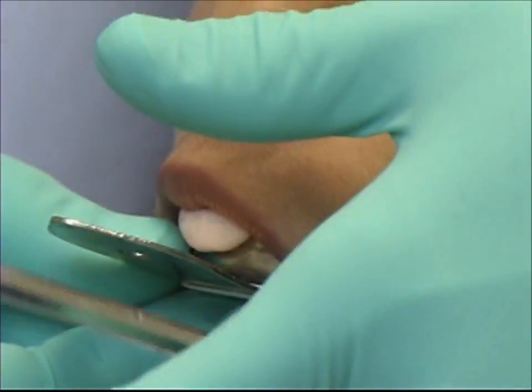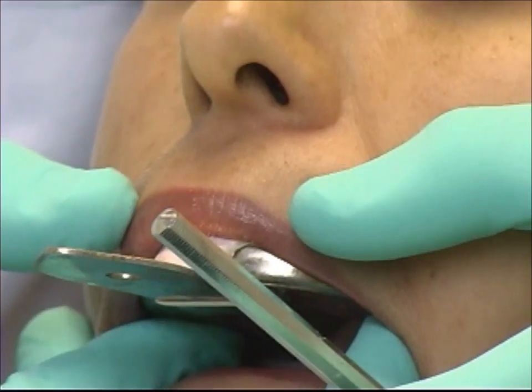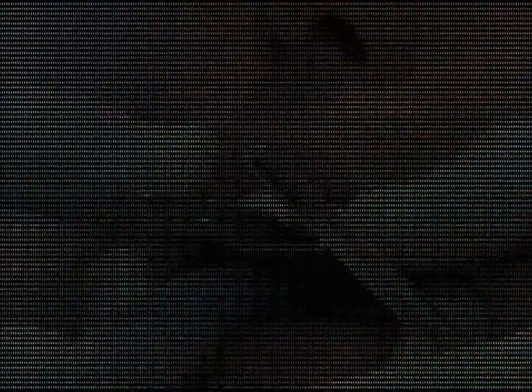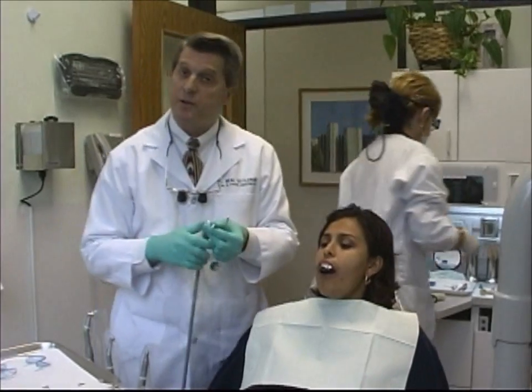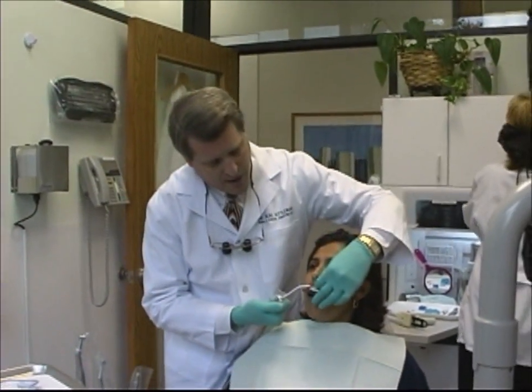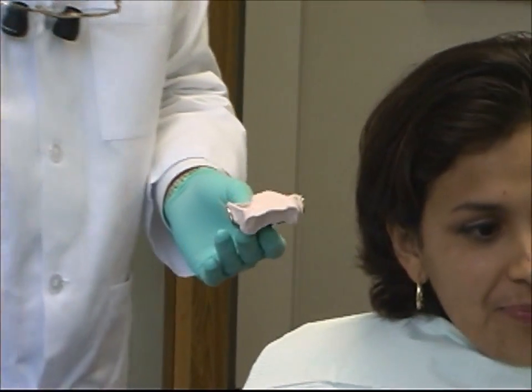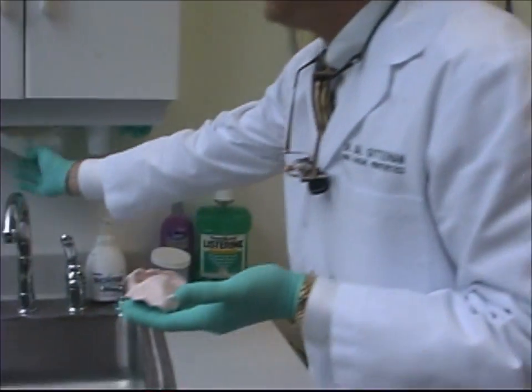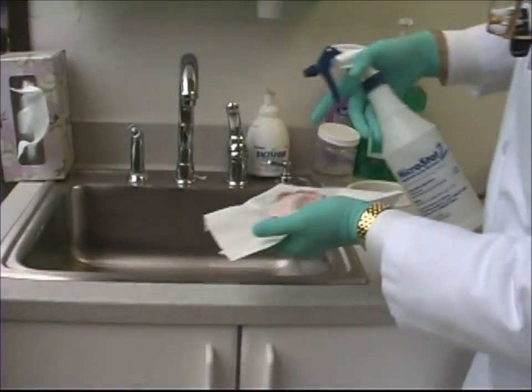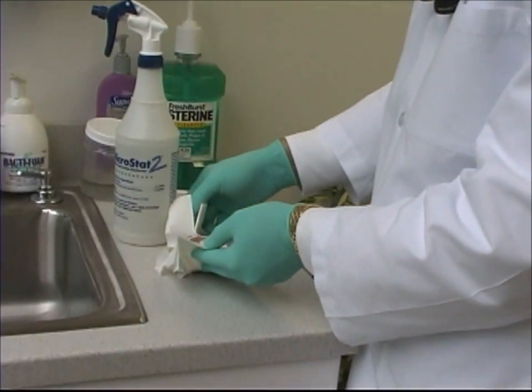I'm going to place this in the mouth and hold it for approximately a minute, a minute and a half. I'll blow some air to help release this tray. Now this will need to be poured at a later time — we will spray disinfect it — but it will have to be poured in a reasonably short order or it will distort.